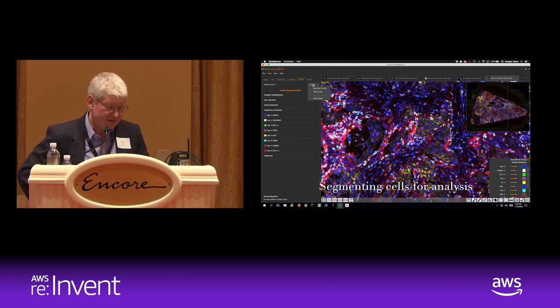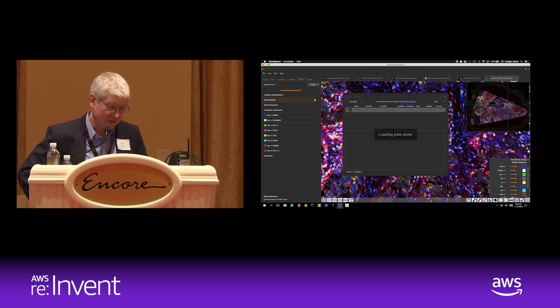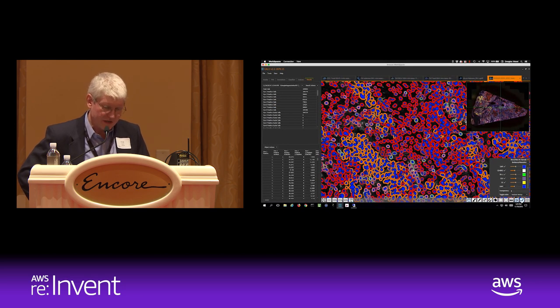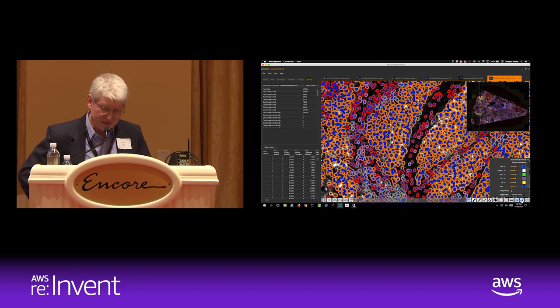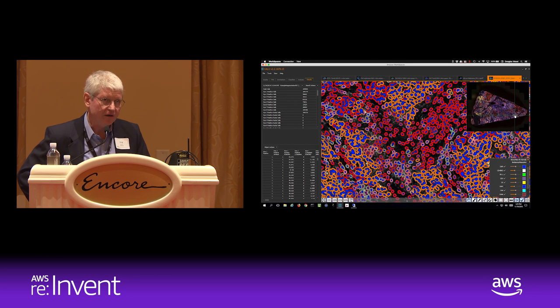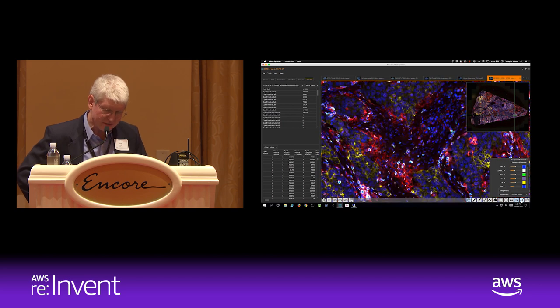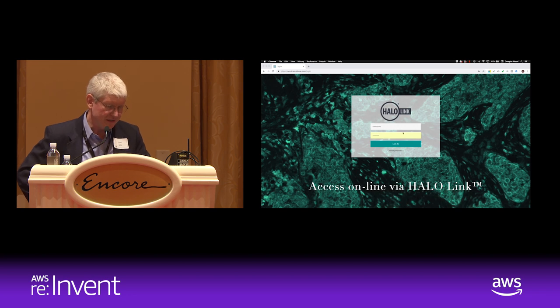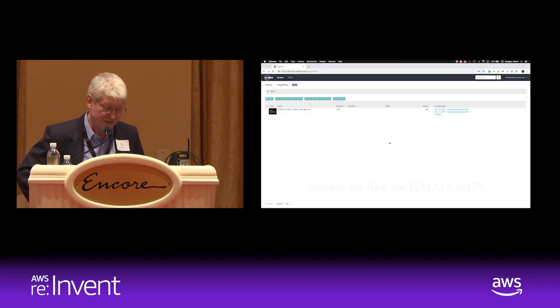Now I'm going to do a segmentation analysis. It's just a quick view at what that might be. This job is running, and multiple cores are processing individual tiles to, for every cell, find its location, its shape, the center of the nucleus, and a cytoplasm region around each nucleus. And for each cytoplasmic region, it's identifying whether it's positive in that marker or not with a simple thresholding. You can see, as we turn it on and off, the graphical overlay of the analysis. And on the left, you can see the analysis results.